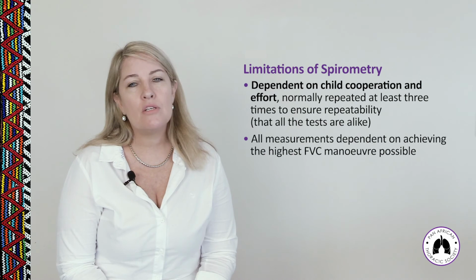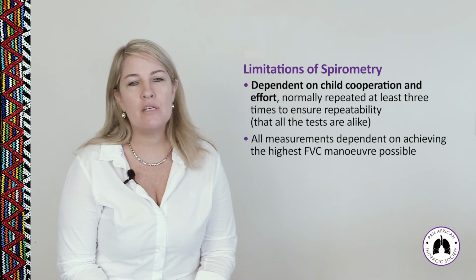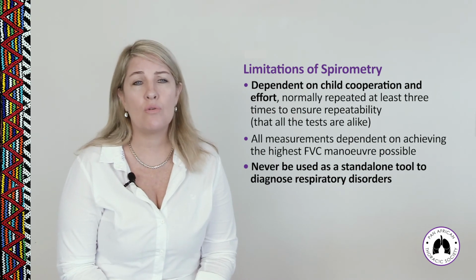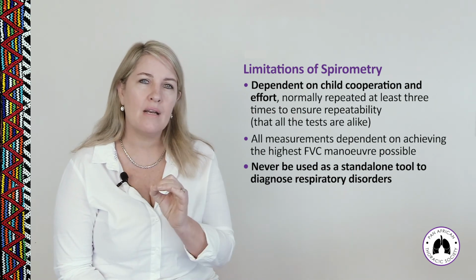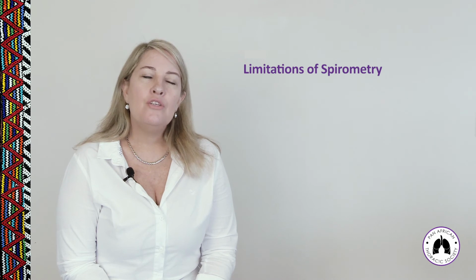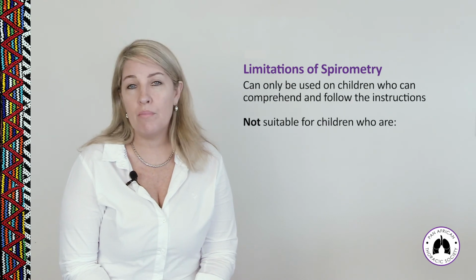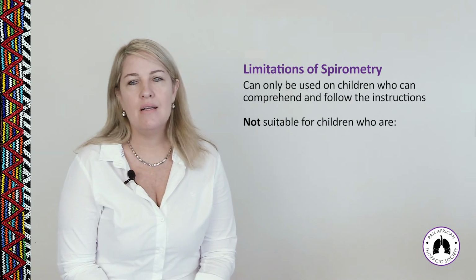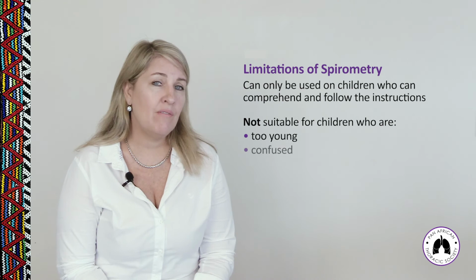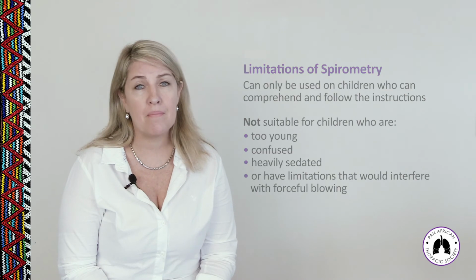All spirometry measurements are dependent on achieving the highest FVC maneuver possible. And additionally, spirometry should never be used, as I said before, as a standalone tool to diagnose respiratory disorders. We always use it as just one tool for making an interpretation on a patient. Due to the patient cooperation required, spirometry can only be used on children who can comprehend and follow the instructions given. Thus, this test is not suitable for any child who is too young, who may be confused or heavily sedated, or has any other limitations that would interfere with forceful blowing.